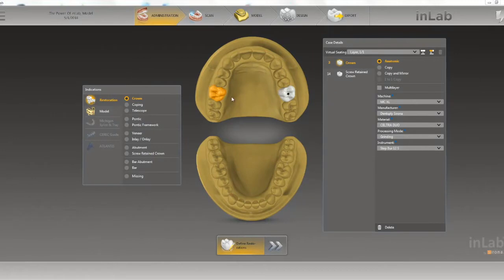After we choose our teeth that we want to do — here we're going to do a crown and a screw-retained crown.